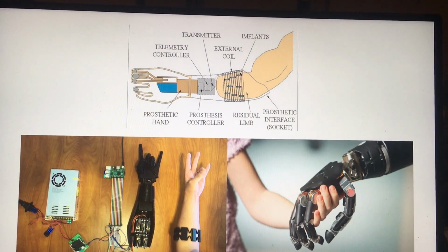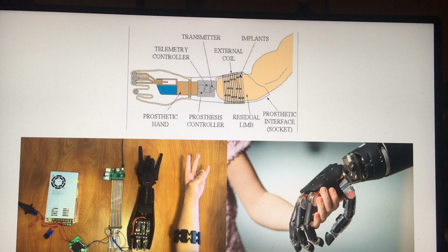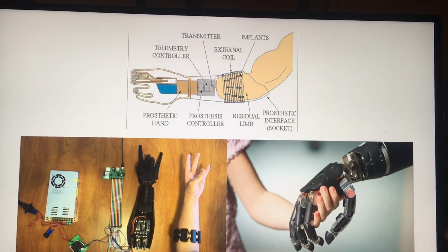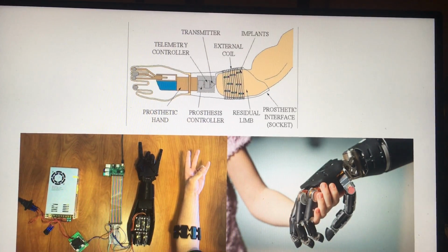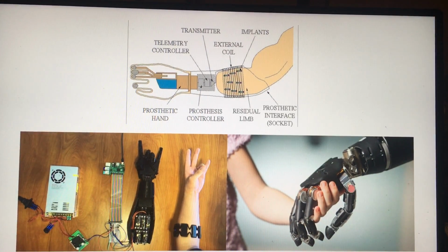The picture on the top shows how EMG signals and batteries are organized within the hand. The other 2 photos show different EMG devices and the EMG electrodes that are attached to the arm to catch the impulses.